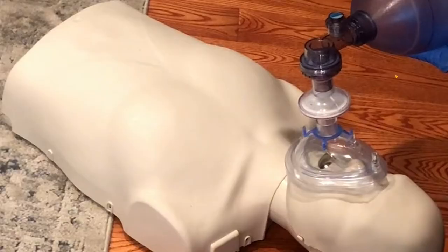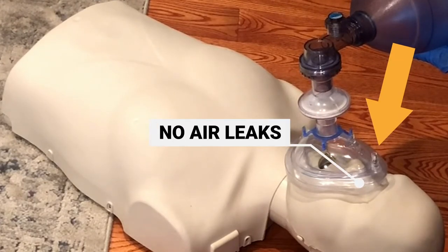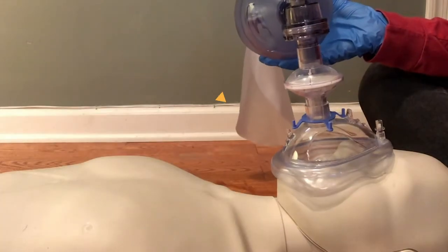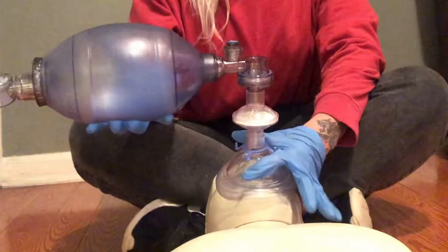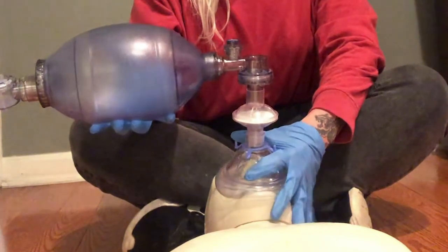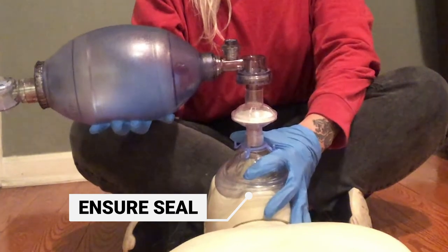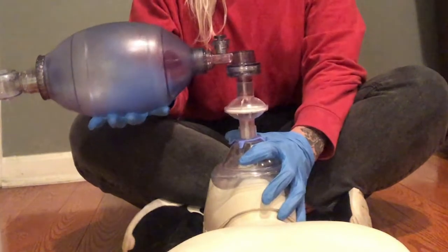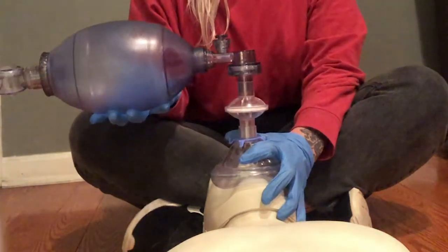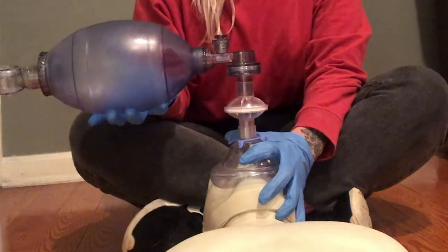Place the nasal portion of the mask over the nose high enough to cover the bridge without air leaks. Make sure the mask isn't touching the person's eyes. Next, cover the bridge of the nose and the person's lower lip with the mask to achieve a proper seal. Grip the mandible with the three fingers of the E grip and pull the chin into the mask, creating a seal and opening the airway. Lift the chin with your E fingers to make sure the airway is open. Be sure to pull up only the bony parts of the jaw, because pressure to the soft tissues of the neck or under the chin may obstruct the airway.